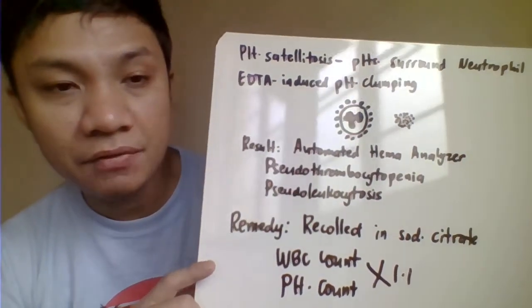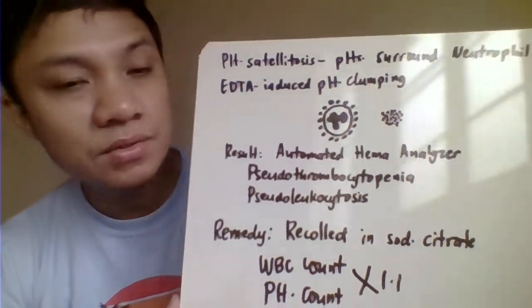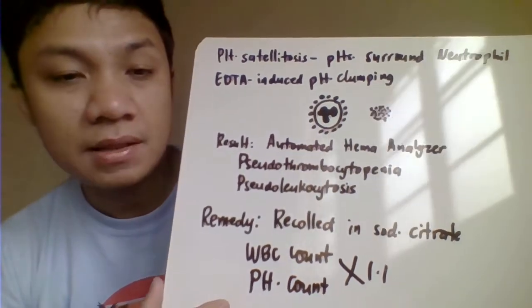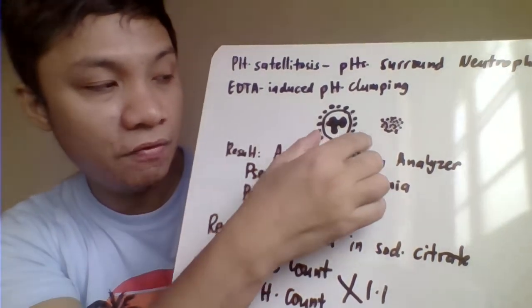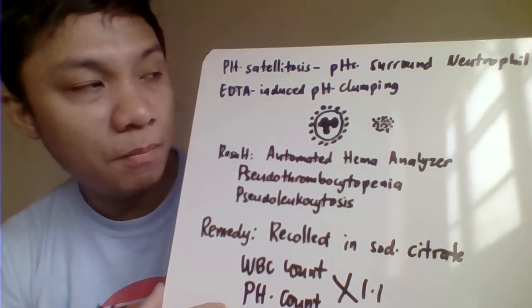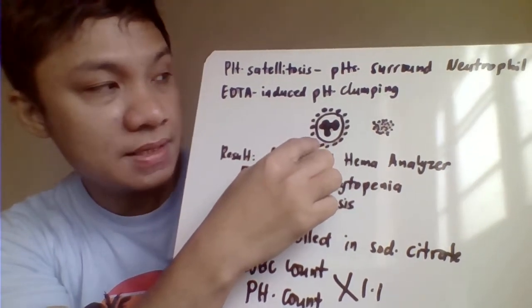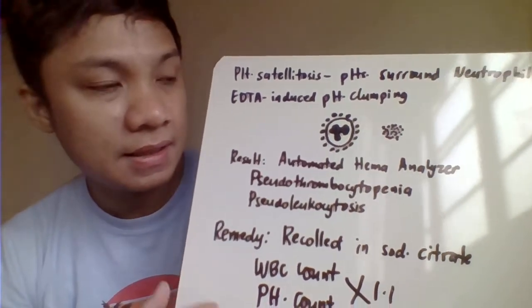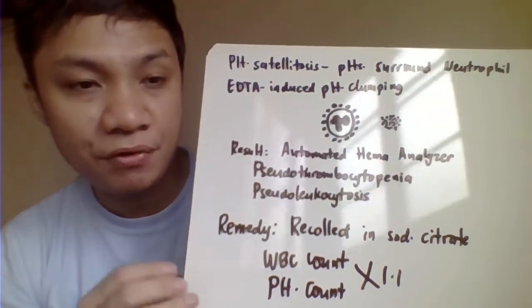However, there could be instances where blood collected in EDTA would have the following disadvantages. The first one is platelet satellitism or platelet satellitosis. It is characterized by platelets trying to form a satellite, or surround, your PMN or polymorphonuclear neutrophil. It would look like this. Another one is EDTA-induced platelet clumping, which is characterized by this, where your platelets form a clump.